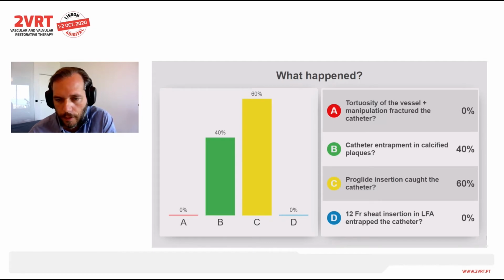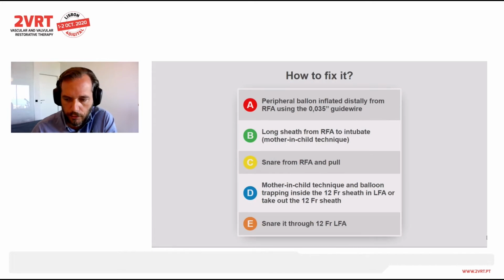So, more or less a divided audience, but still the majority of people think that there might be a question of the ProGlide insertion that caught the catheter. So, the next question that I pose to you is how to fix it.